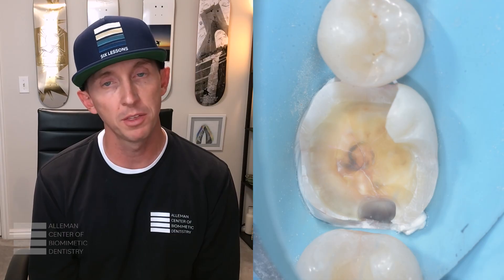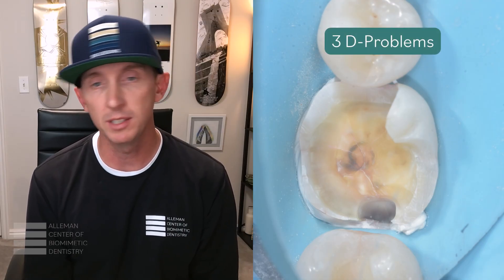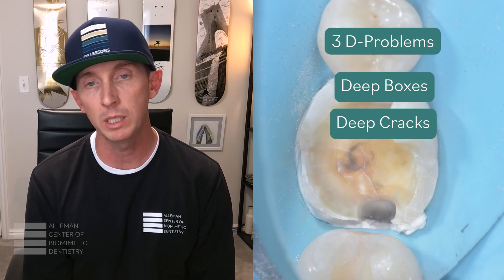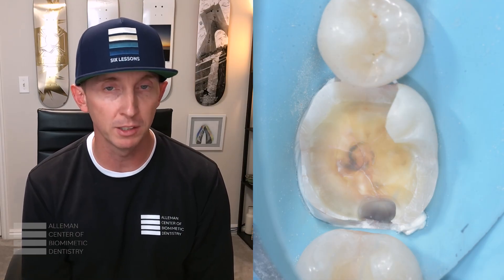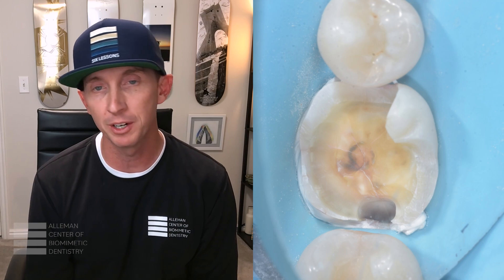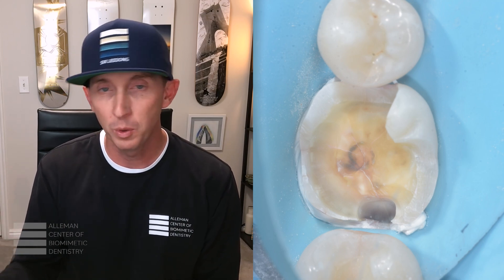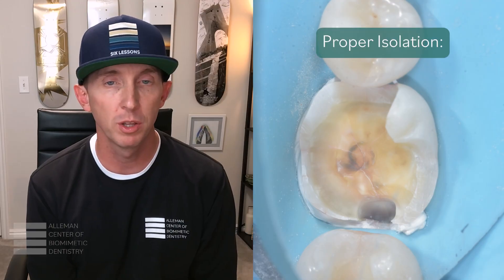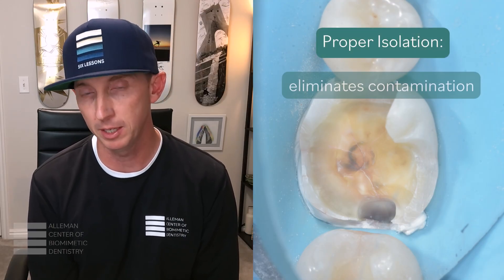When we train a doctor, oftentimes we talk about the 3D problem, where you're dealing with either a deep box, deep cracks, or deep decay. Each of these have unique challenges, but one thing they have in common is that we are now below the gum tissue. We have to ensure that we have proper isolation so that when we use our adhesives, we don't have any contamination.